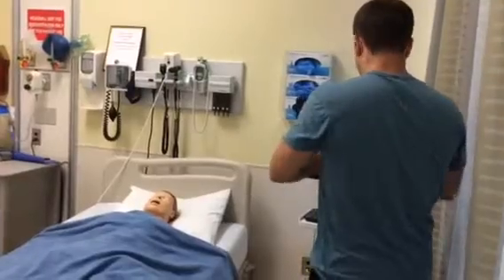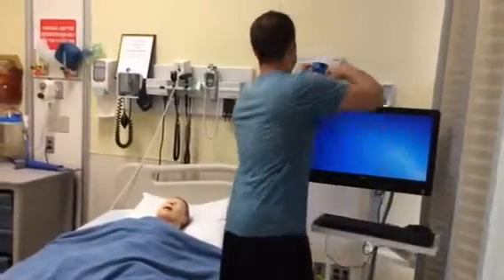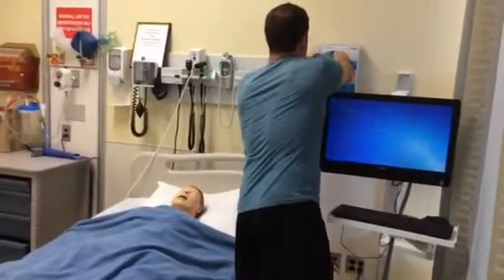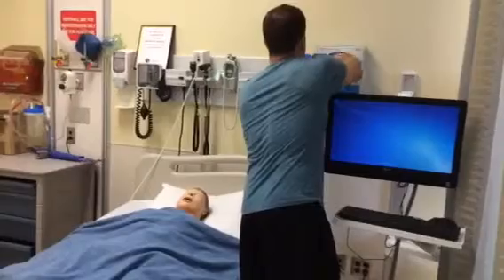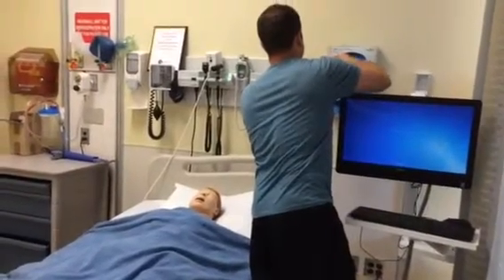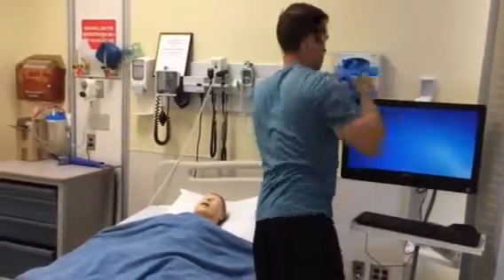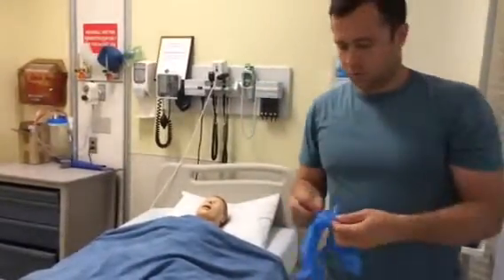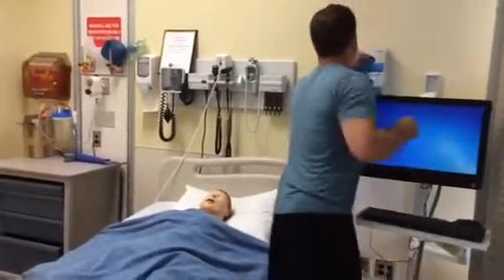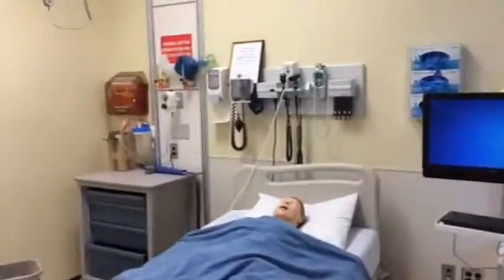Okay, looks like we're going to be inserting a Foley catheter. Have you ever had that done before? Good. Well, we're going to make sure that it's painless and as smooth as possible. Let me put on some gloves here. So I would put on gloves at this point. And so let me get you set up.